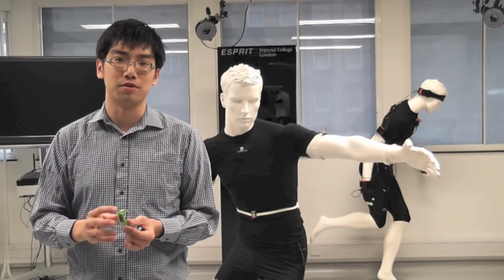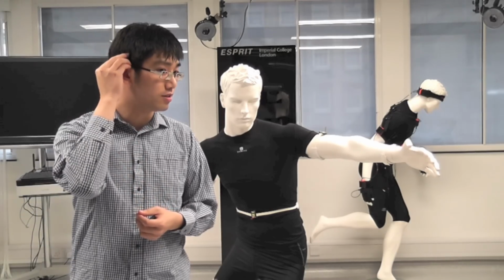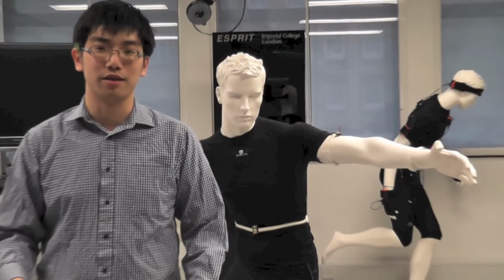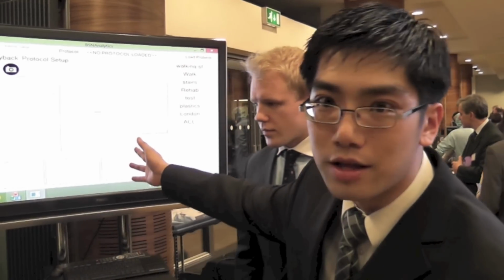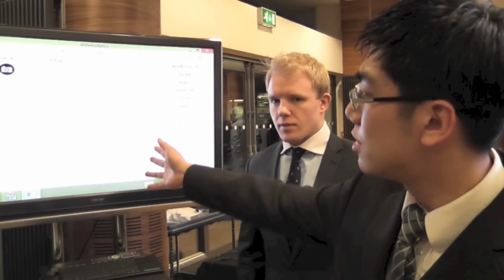The sensor is a wearable device. It captures the movement of people. So when you wear it on the ear like this, and you walk, it can measure the movement. Hi. So today we have this EAR sensor here. The EAR stands for ear-worn activity recognition. And what this sensor contains is a 3-axis accelerometer, which communicates with the application that you can see running on this screen here.